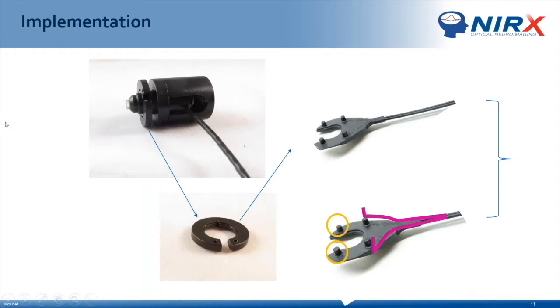The ones marked in purple are two different fiber optics at two different locations, but they both join to form one. So basically, we are measuring the average of 2 points. And why do we use two fiber optics in these short detector clips? Firstly, if you double the fibers, you get a little bit more light. Since these are small fibers, they pick up much less light than our regular detector fibers. Secondly, we would like to avoid any local effect.